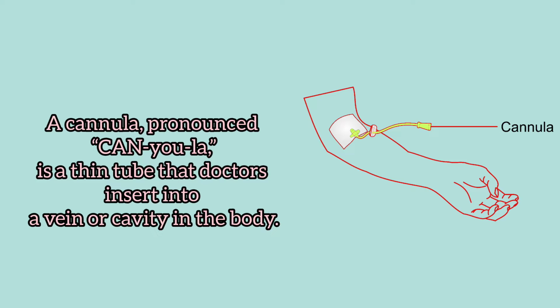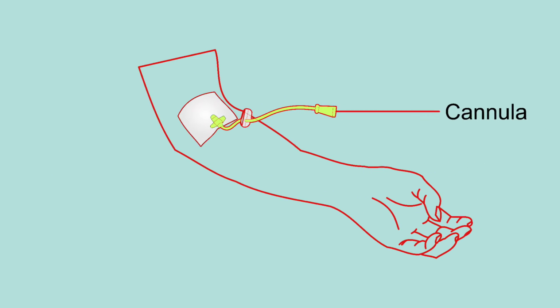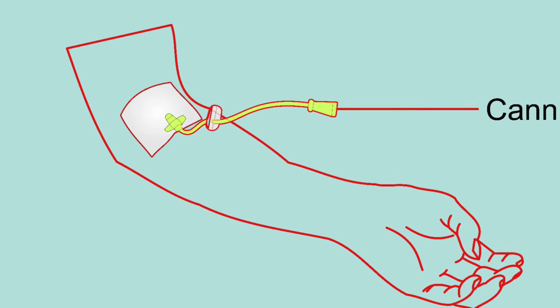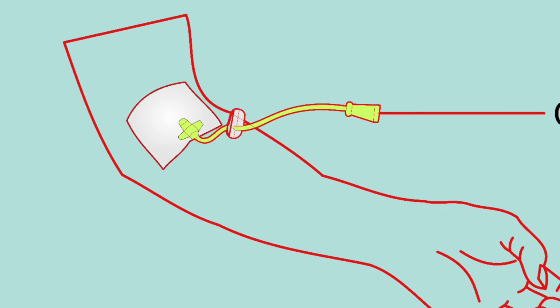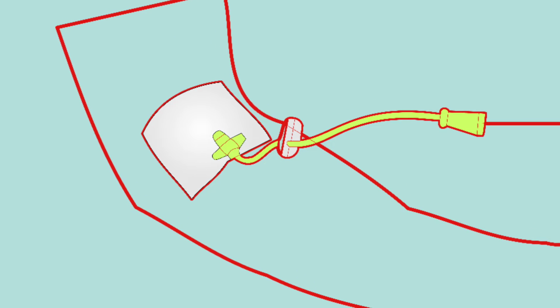A catheter typically refers to a larger plastic tubing that is inserted into an area of the body that already has an opening, such as the bladder or an open wound that needs assistance in draining. A cannula typically refers to a small plastic tubing that is inserted into part of the body with the aid of a needle that punctures the vein or vessel. The needle is then removed, leaving the cannula in place for easy access to withdraw or inject anything into the vessel. IV cannulas and nasal cannulas can pose different risks.